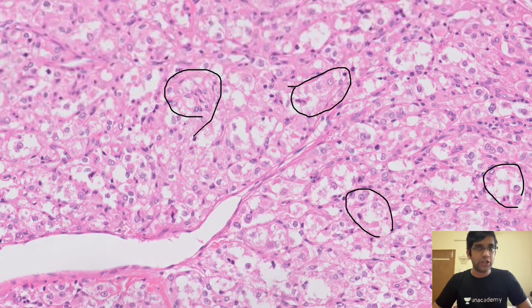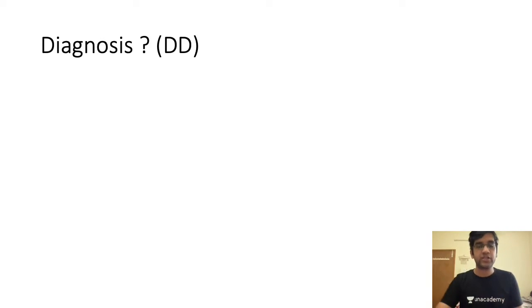I have a differential diagnosis here. Again, the main differential diagnoses will be, as I said, alveolar RMS, granular cell tumor, or alveolar soft part sarcoma. Alveolar soft part sarcoma is much higher up because it's not a granular cell tumor since it's pleomorphic, it's a sarcoma, and I don't see any rhabdomyoblast, no rhabdoid cells per se. They're all polygonal cells with eosinophilic cytoplasm, not rhabdoid cells. So I'm going to rule that out as well. So my first preliminary diagnosis here is ASPS. ASPS, though it is rare, can definitely come in an exam case for you, right? Alveolar soft part sarcoma. I hope you must have seen cases. If you haven't seen cases, this could be a case for you to open this spectrum.